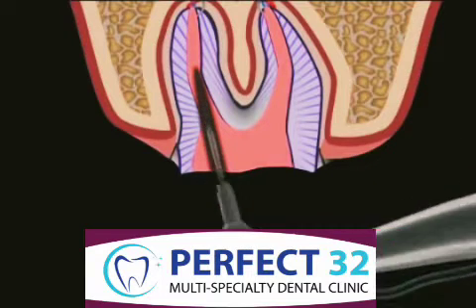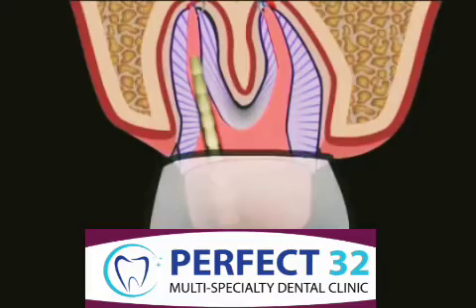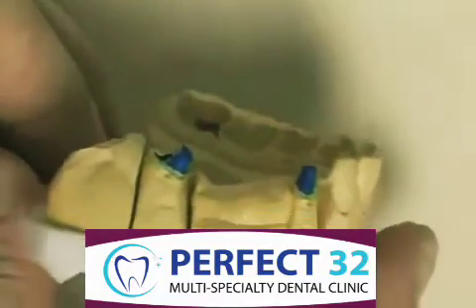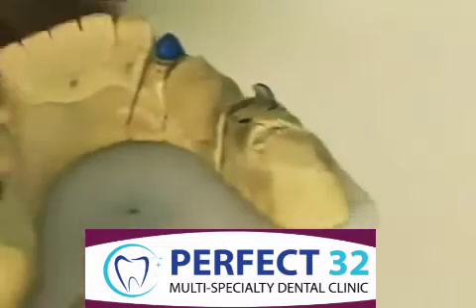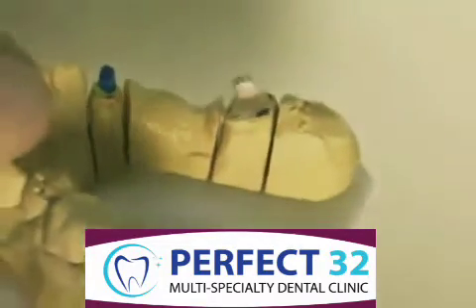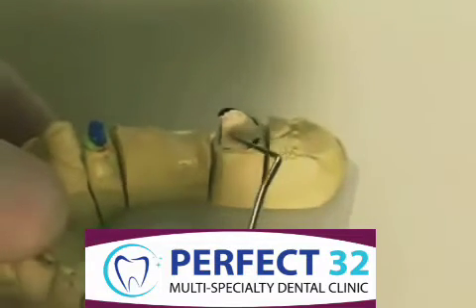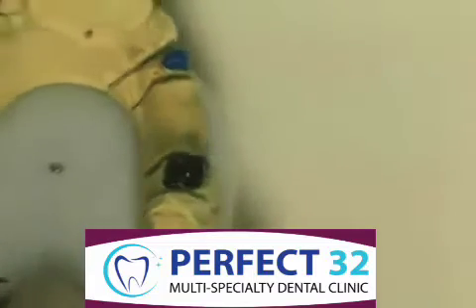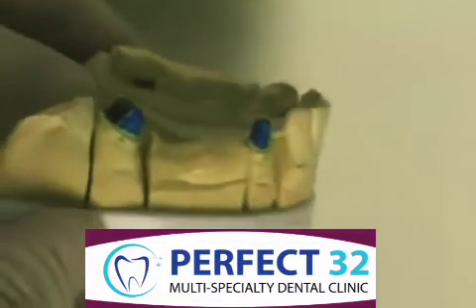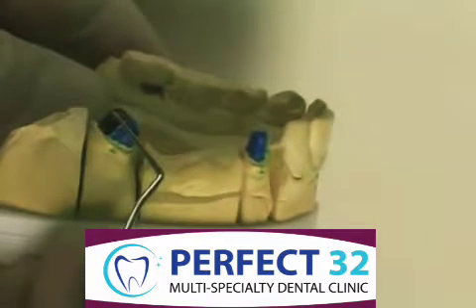In dentistry, a dental crown supported by an artificial buildup is called a post crown. In this video, you see a patient's plaster impression. There is nothing left of the tooth, but a small part, shown in blue here, protrudes from the gums. A dental bridge wouldn't have any hold on this core. By building up the core, shown in black here, the bridge can be fastened. In this case, the post tooth does not support a single crown, but an entire bridge.